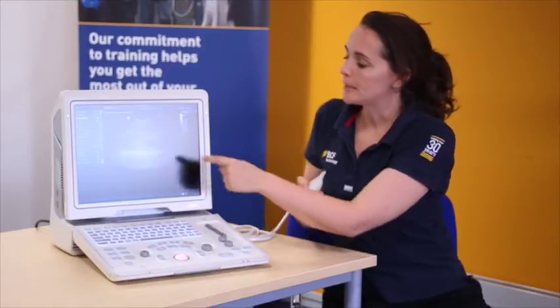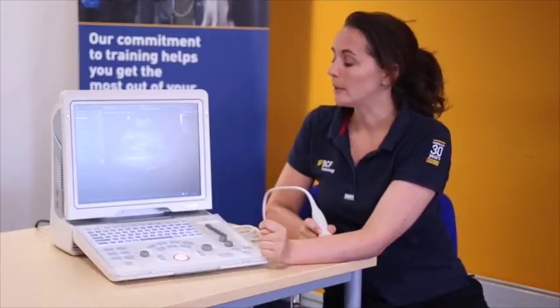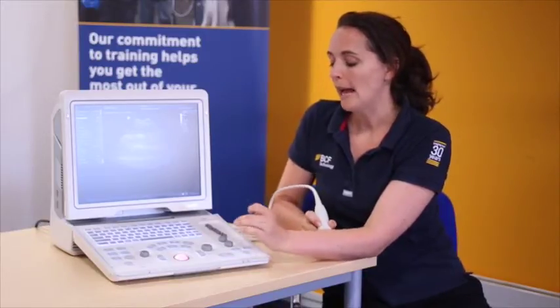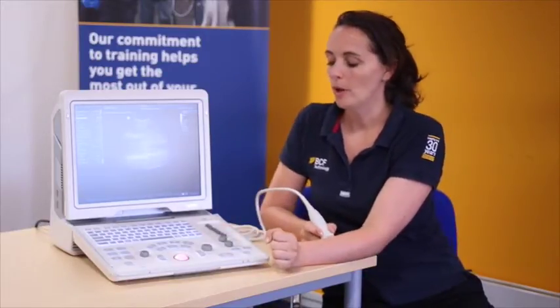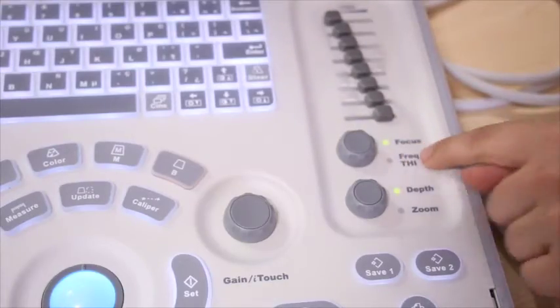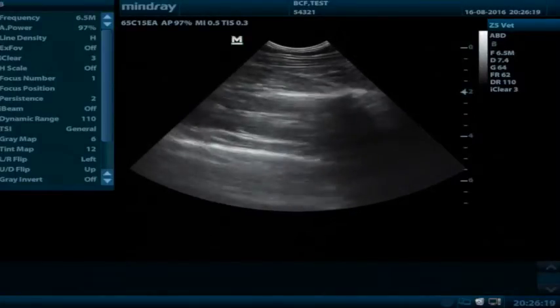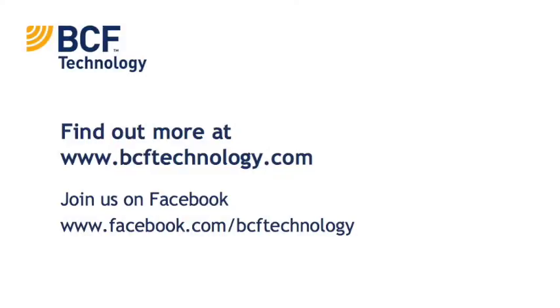The final thing we want to look at is our focal position. Our focal position, as we've previously said, is denoted by a triangle on the depth gauge. By pressing the button on top of the dial, the green light highlights the focus, and then we can move the focus up and down to our level of interest.